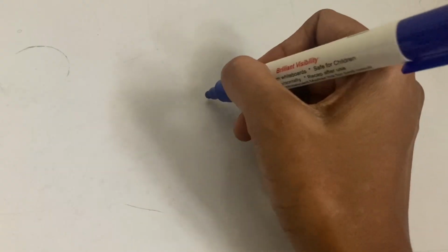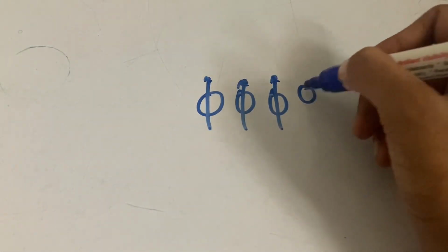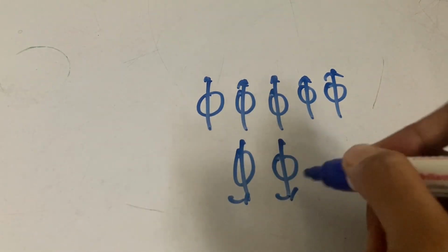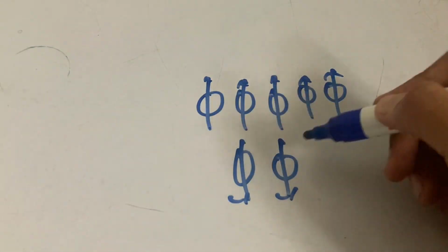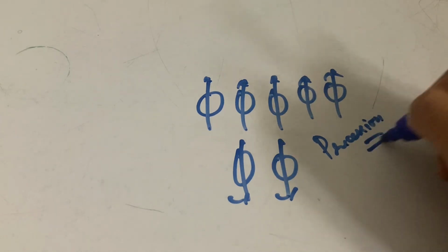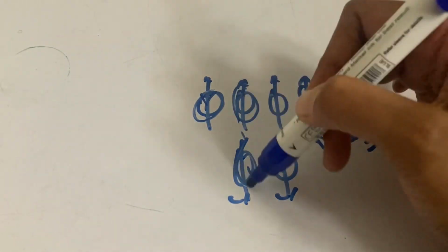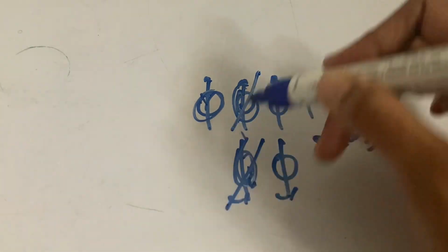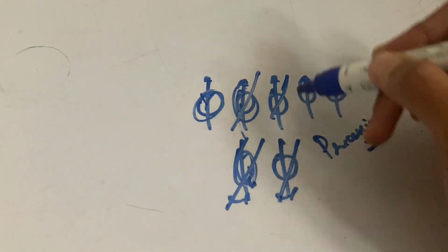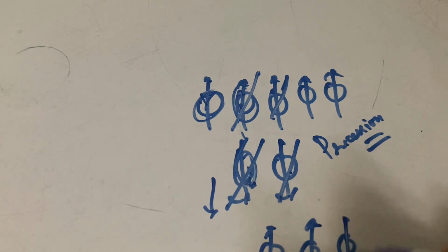As I told you, in an external magnetic field, some protons align parallel and some align anti-parallel, and they have a movement called precession. You have to remember that this proton and this proton are opposite to each other, so the magnetic force of this proton and this proton, these vectors, cancel each other. At the end we have certain protons that are pointing upwards.